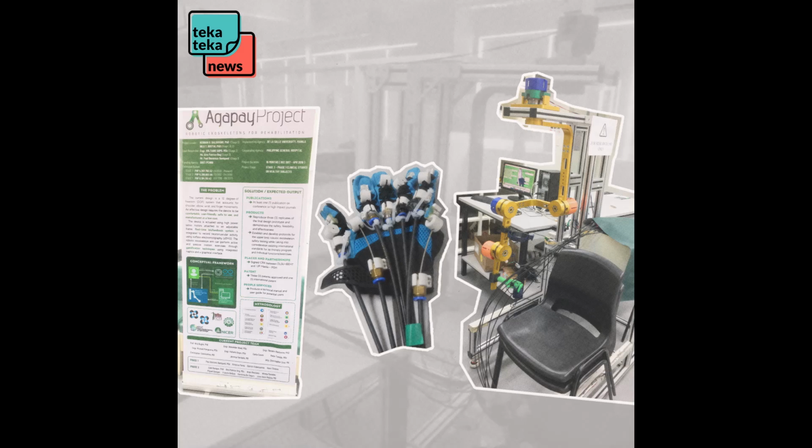The end goal is still to make it a wearable robot that can be used for assistive purposes and not just rehabilitation. Assistive technology means it's something you can carry around with you to help you with your daily life. Like crutches. Yun yung question ngayon eh. The initial project was really for rehabilitation medicine. Pero you cannot stop kasi at that point.